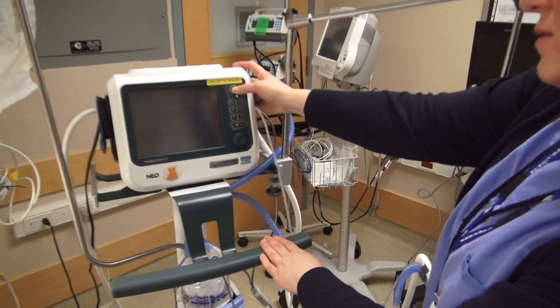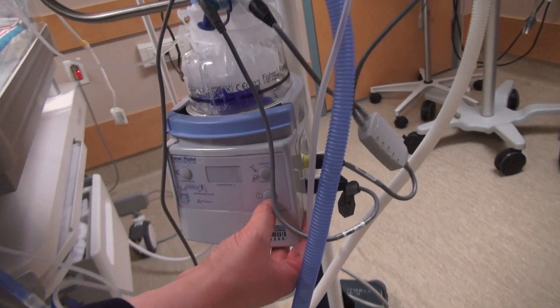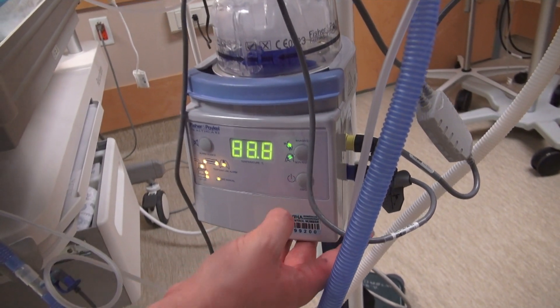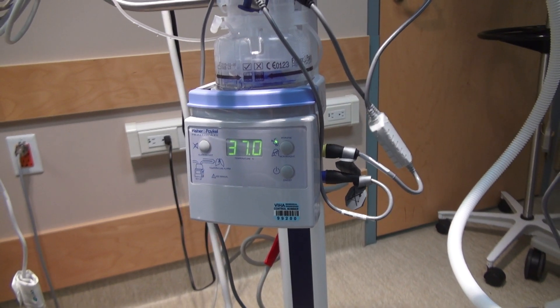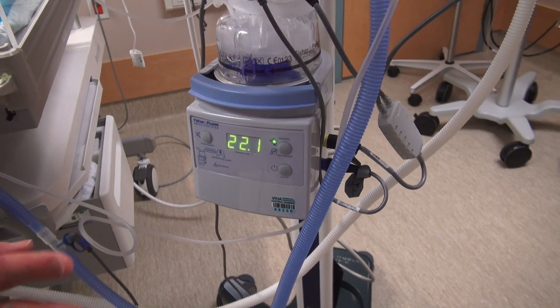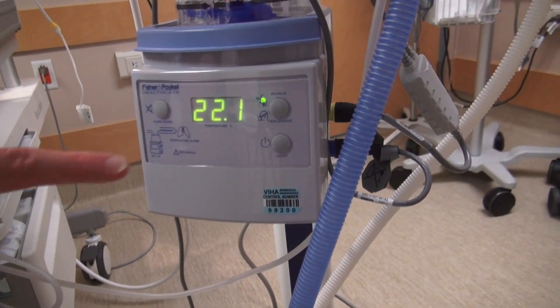Prior to use, turn on the Fischer-Beckel Heated Humidifier. Default settings are set to Invasive at 37 degrees. This is what it should be set for both nasal CPAP and in ventilator mode for the neonate. Please do not change unless instructed to by the pediatrician. It will take 20 to 30 minutes to heat up to the right temperature.